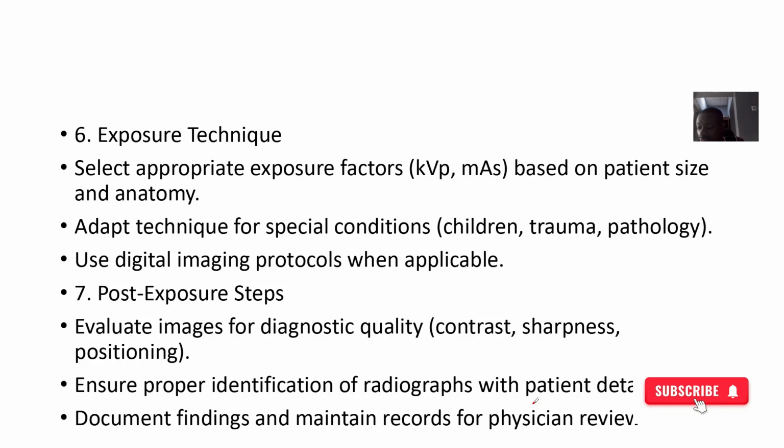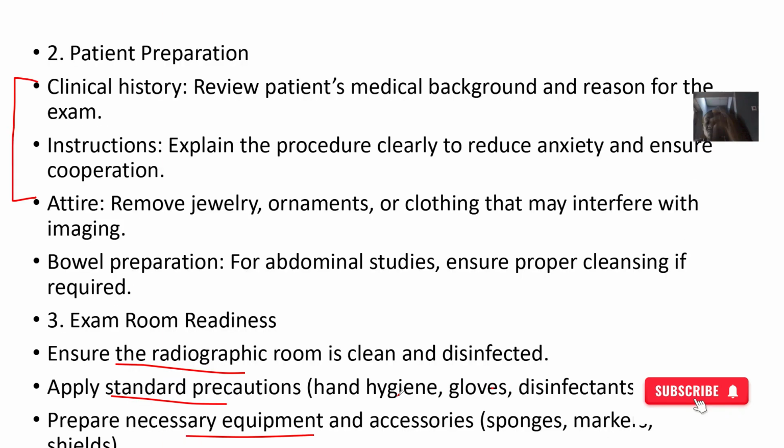For exposure technique, you have to ensure that the amount of radiation energy that the patient is exposed to is just what is needed for the diagnosis. Then after the exposure, you have to evaluate and make sure that the image is good before the patient goes out of the place. And you properly document so that you don't take the X-ray or imaging of another patient and give it to another patient.